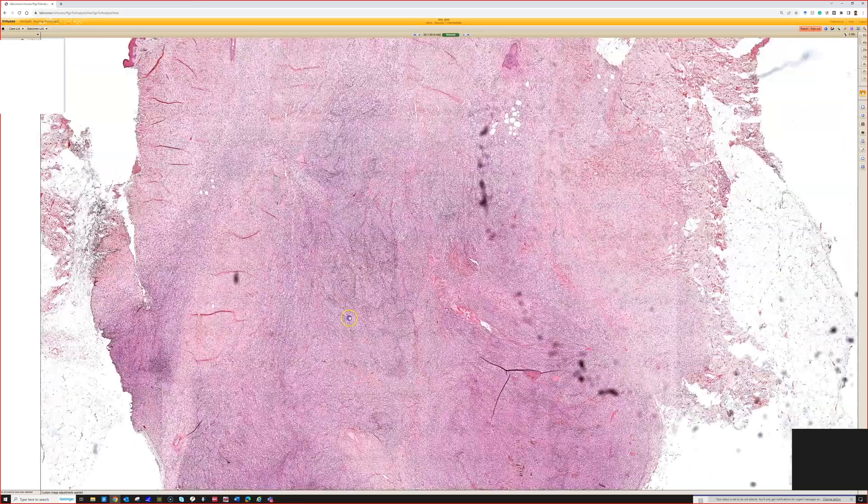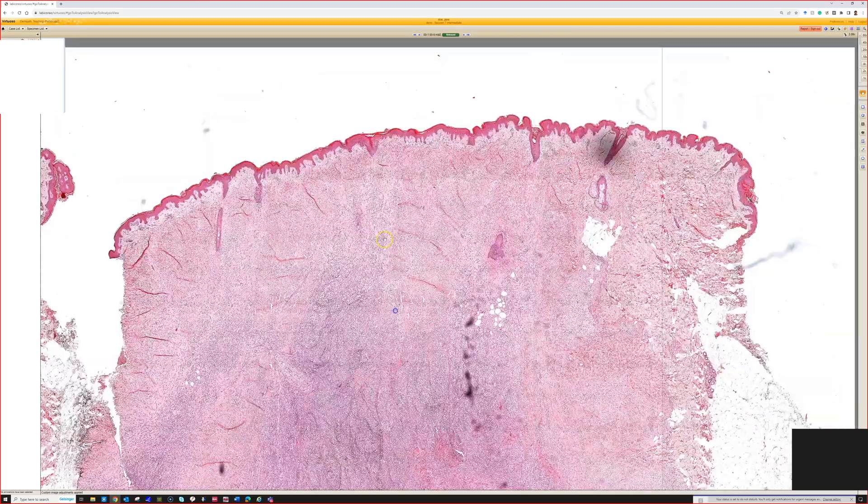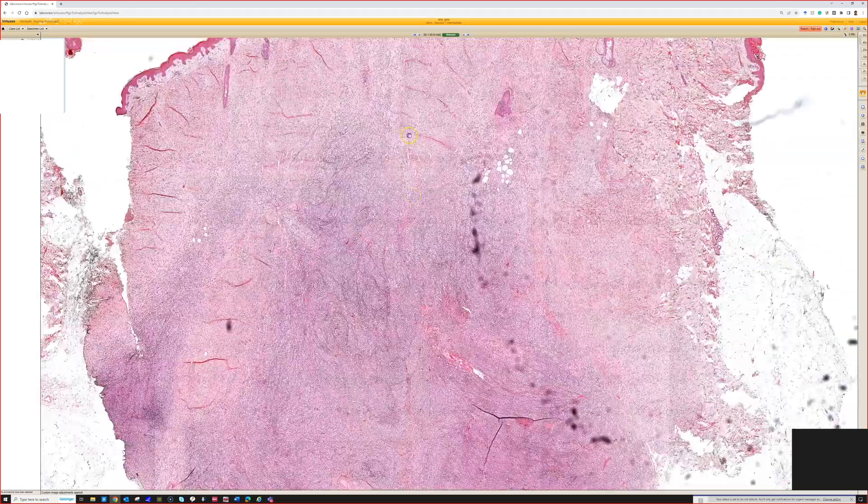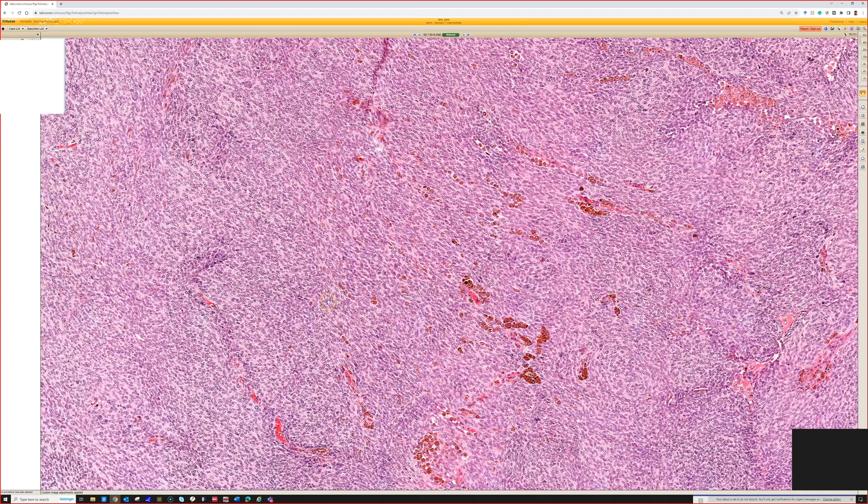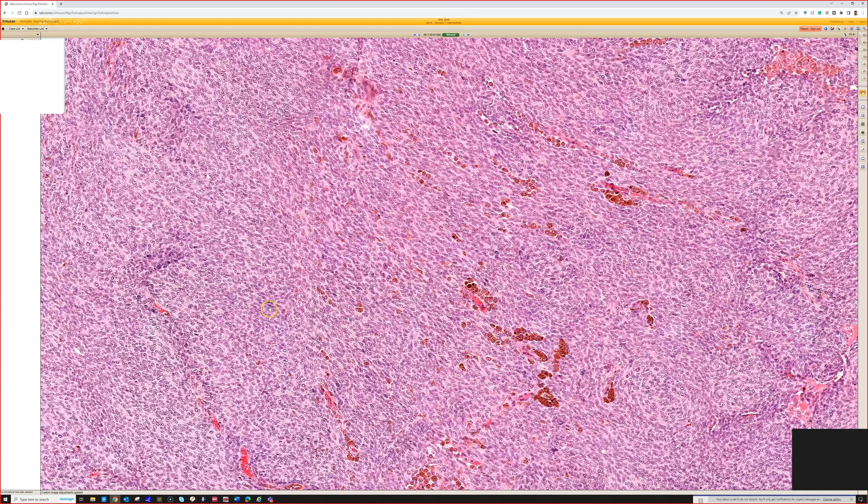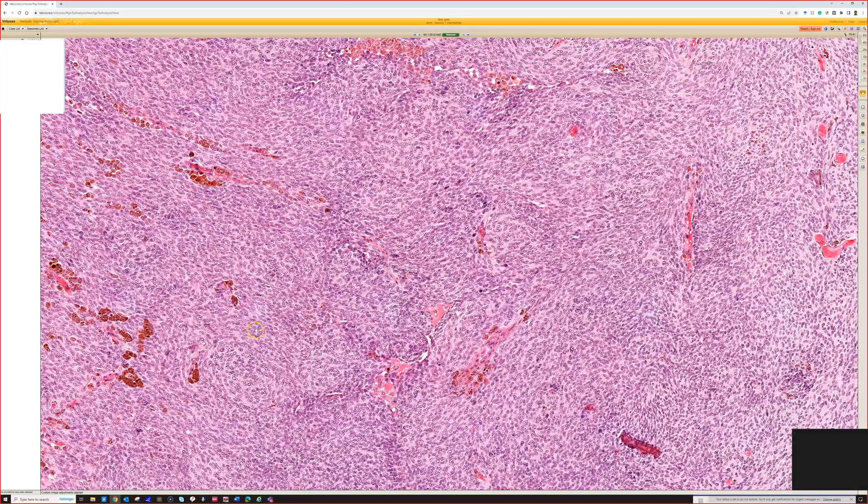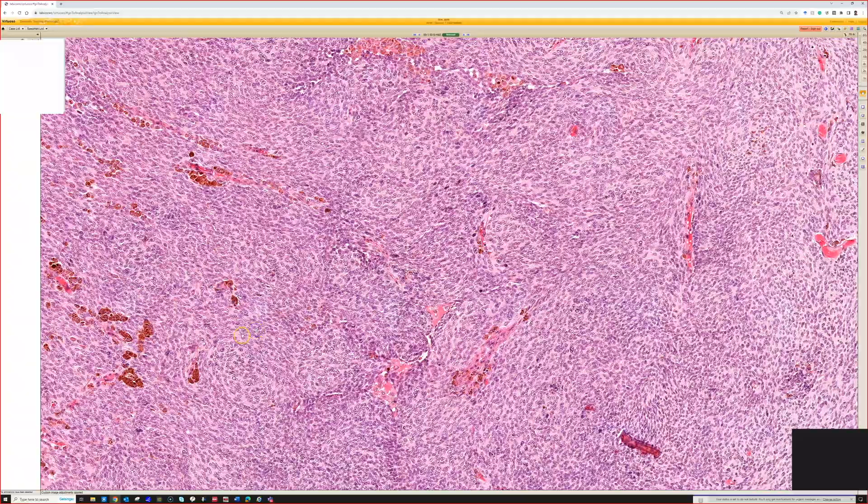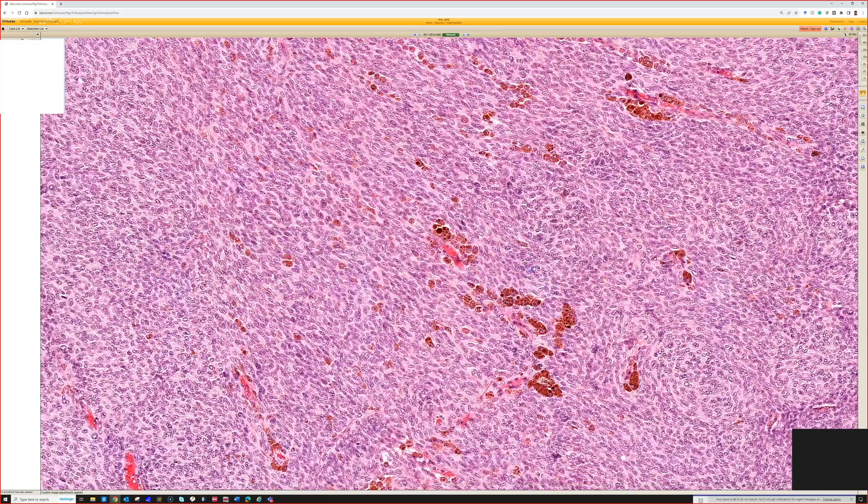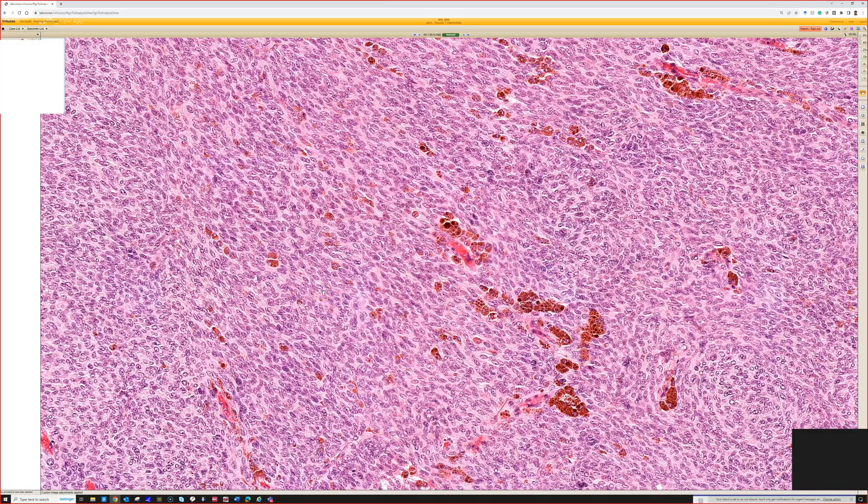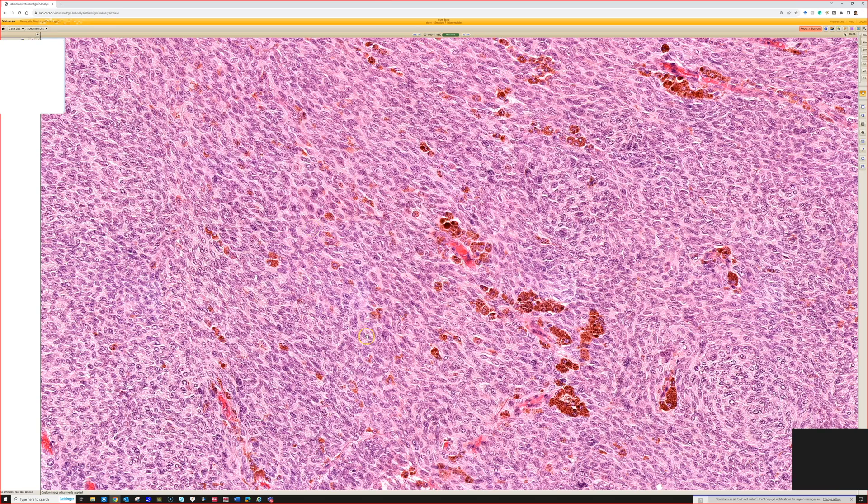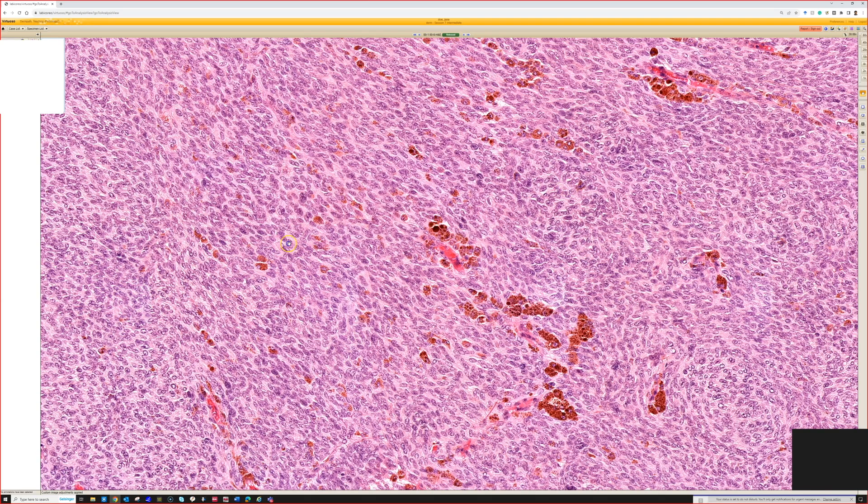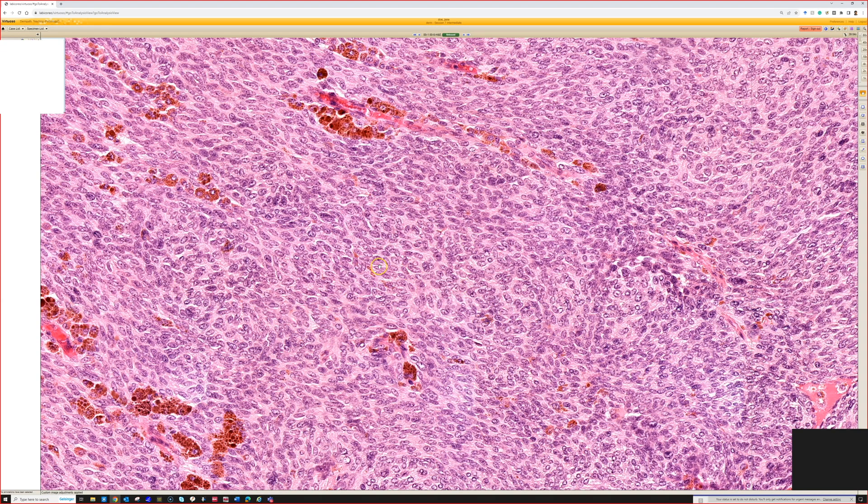That's a clue diagnostically. We have plump spindle cells or fusiform cells—they may look round depending on the plane of section we're cutting in. They're cellular but not very cytologically atypical, not pleomorphic. They have vesicular nuclei with open speckled chromatin and very small punctate nucleoli rather than large nucleoli.